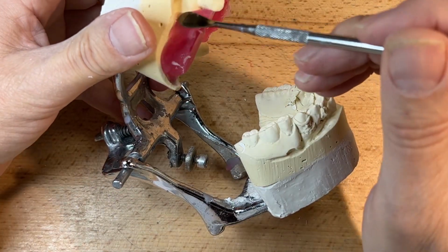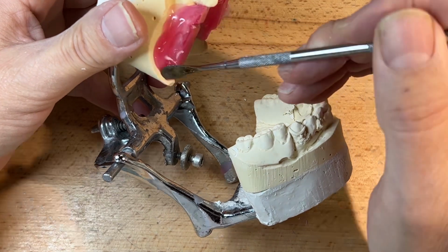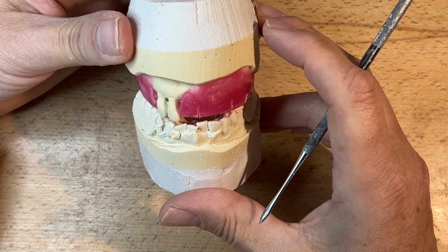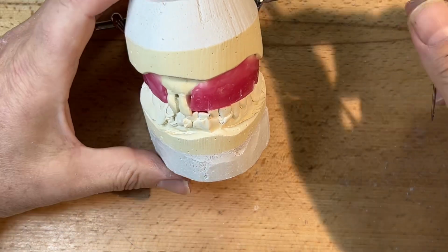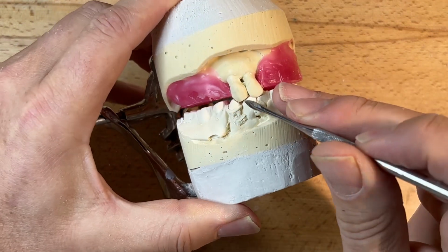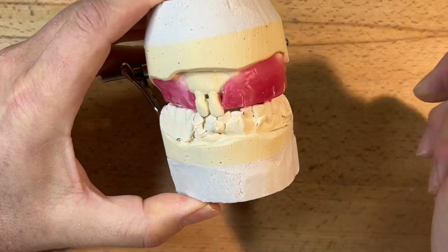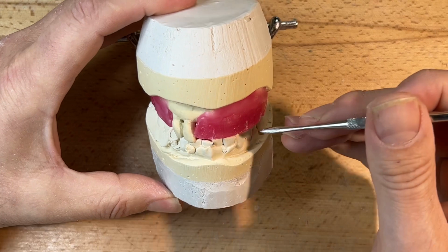We didn't use a semi-adjustable articulator. These lower teeth are going to dictate the excursions. We're going to keep the overbite and the overjet to a minimum, and luckily 1-2 and 1-3 are pretty much end-to-end with minimal overbite overjet, which is a good thing.